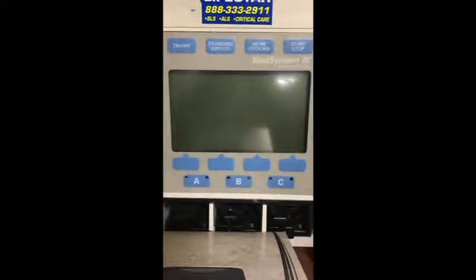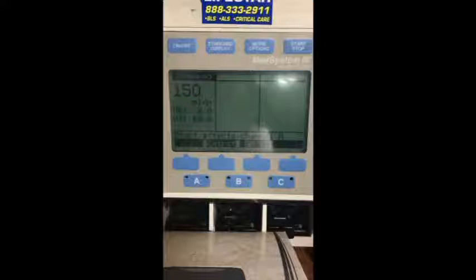Alright, so here is the pump standard screen display. You have the on button. All the lights will flash and come on. You see it pops up in general purpose 2. It should be in general purpose 2 because you should be able to deliver 1/10 of an ml.